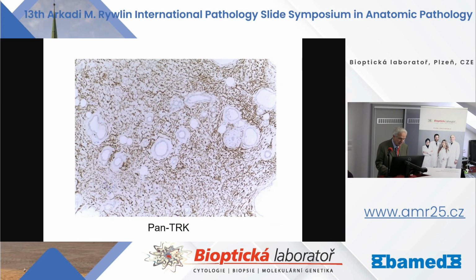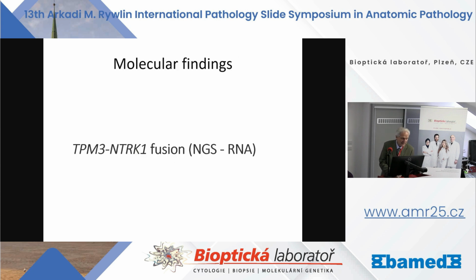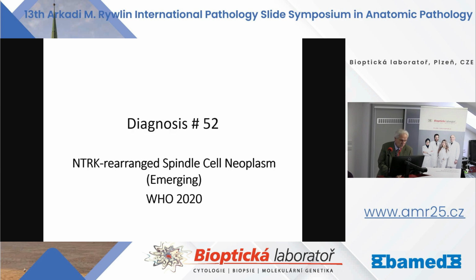Because we performed pan-TRK, and the tumor is immunohistochemically pan-neurotrophic tyrosine receptor kinase positive, and this translocation was confirmed by NGS, and the diagnosis was NTRK-rearranged spindle cell neoplasm, a new entity that was described in 2020 in the WHO classification of soft tissue tumors.